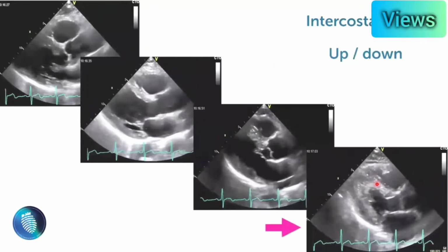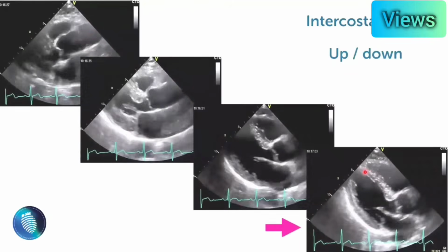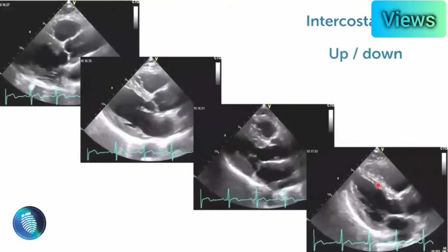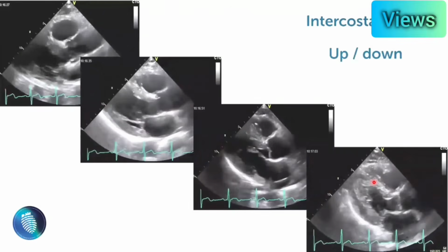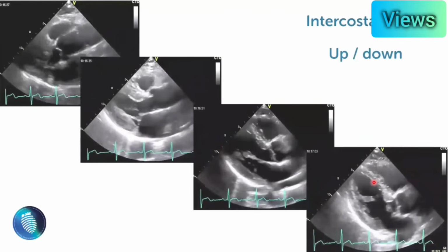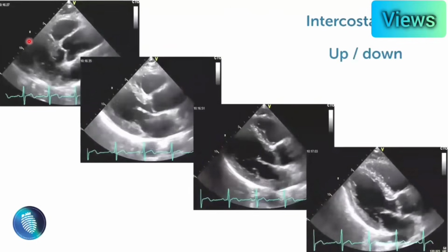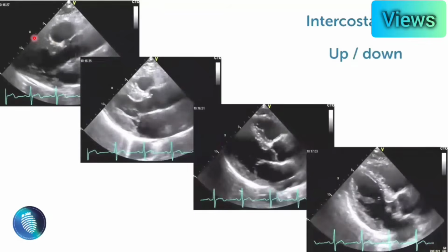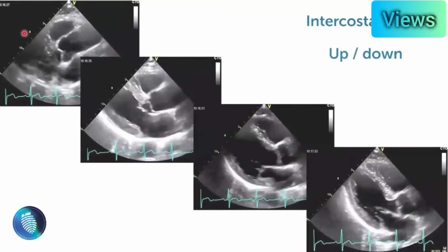And the second problem is that the septum is vertical. And the septum, as we showed in the previous slides, must be horizontal, like the uppermost example, where the septum is transverse.